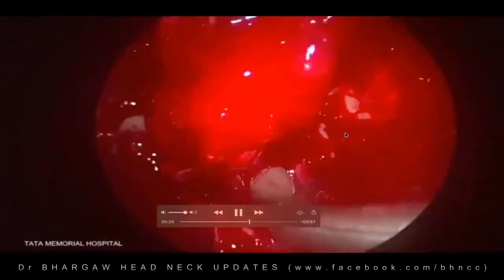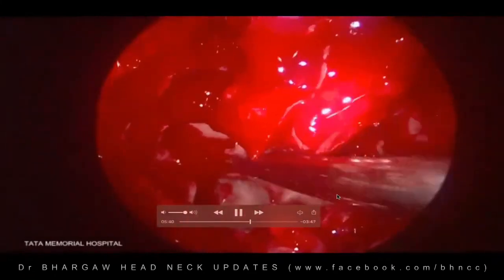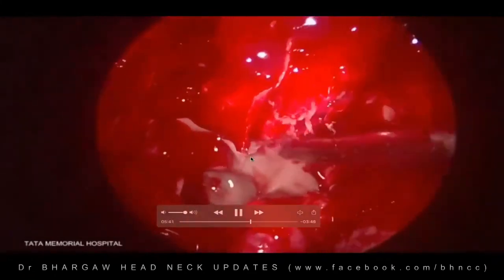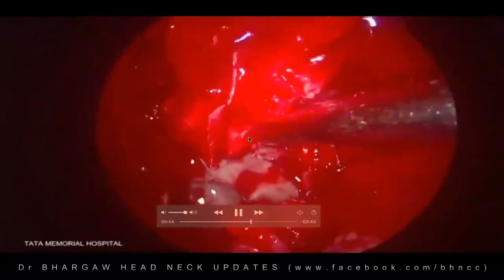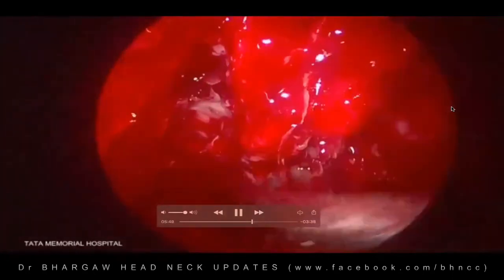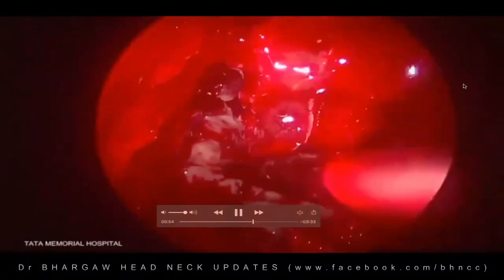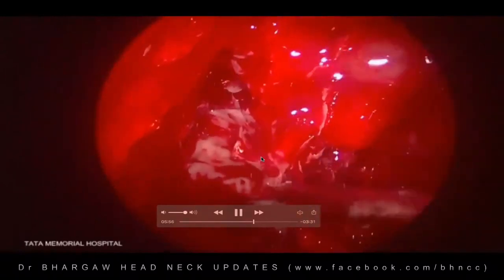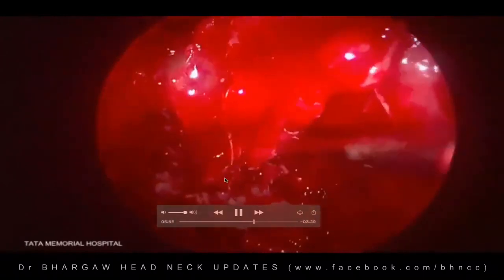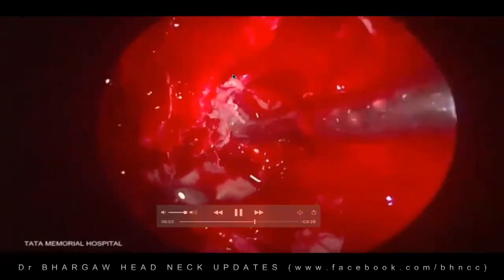You have to be careful here because you want to protect the Hadad flap, which is here inferiorly. That's the sphenoid sinus, and that's the planum area. This is the entire cribriform area here. This is the lamina papyracea on that side, right? You can see here the lamina papyracea on this side and the lamina papyracea on that side. We just drill; the entire tumor on this side has been debulked. Whatever tumor is left is only left on this. That is the basic area of attachment of the tumor.